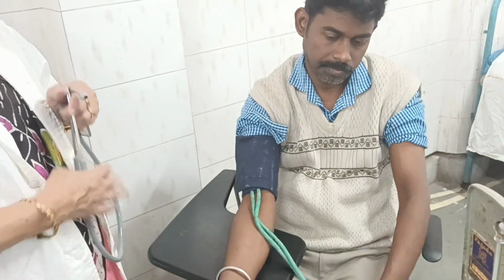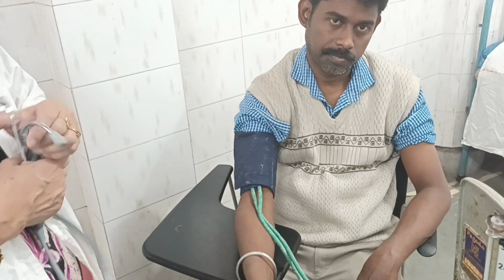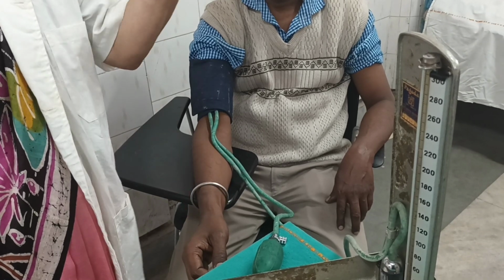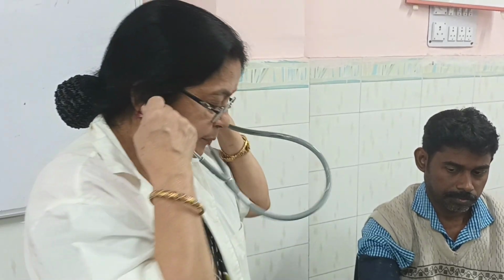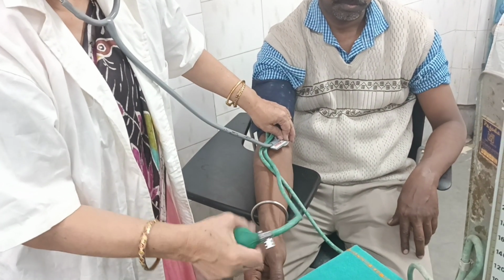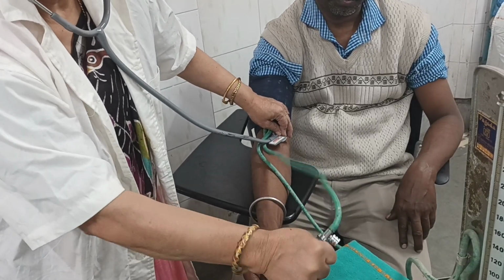See, I am holding it wrongly. I have to hold it like this. Now I am placing it over the brachial artery. Now, how much pressure will I raise in the mercury column? Not just 200 or 240 like that. You have got a rough idea of the systolic blood pressure from the palpatory method. It is 110, so we will raise the mercury column maximum 30 to 40 millimeter mercury more than the palpatory method, that is, maximum up to 150, to be on the safer side. Don't go more than 30 to 40 above the palpatory method, not more than that.